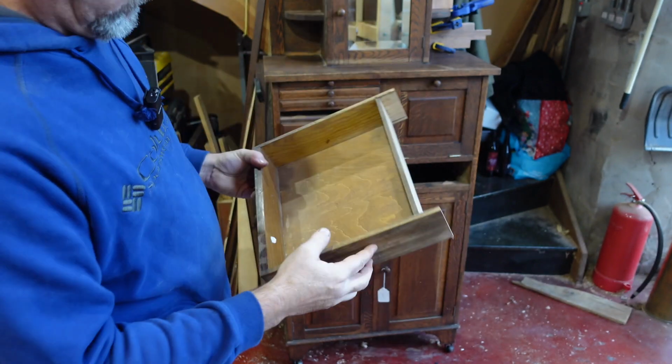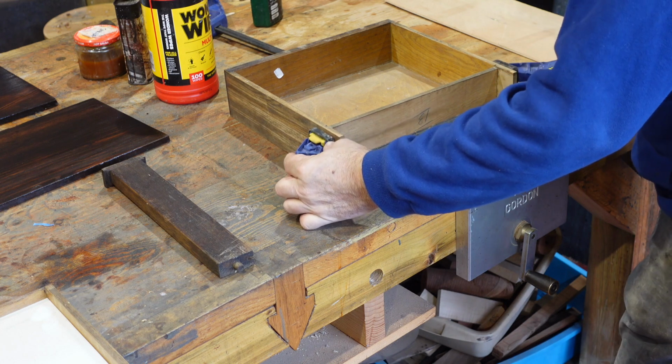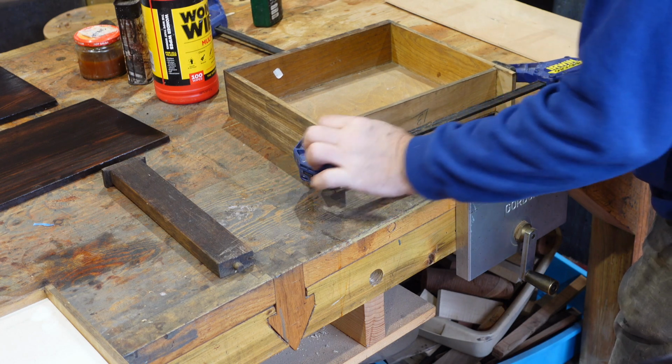Number 13. So what I want to do is apply a bit of gentle pressure. What I want to see is, does it sort of pop or move?